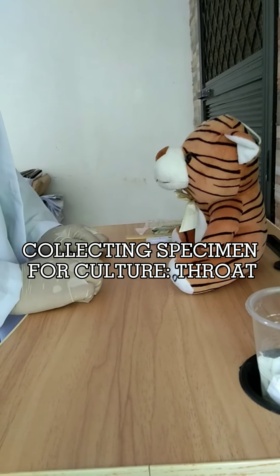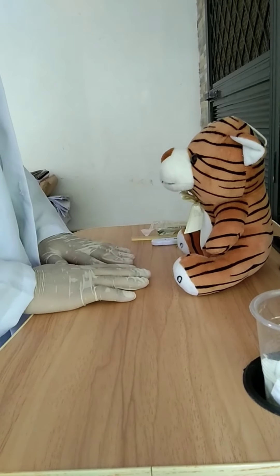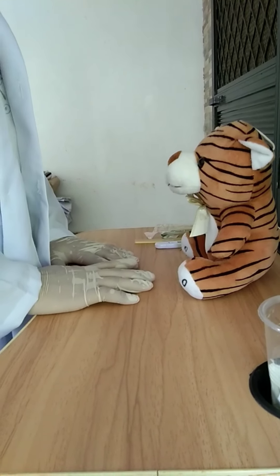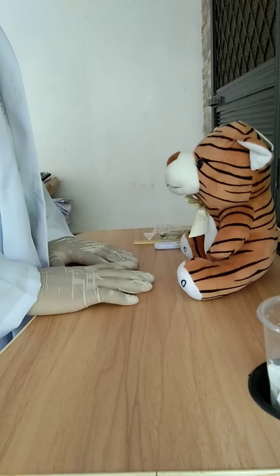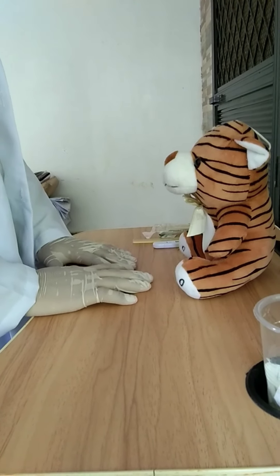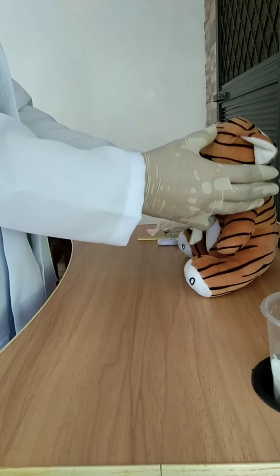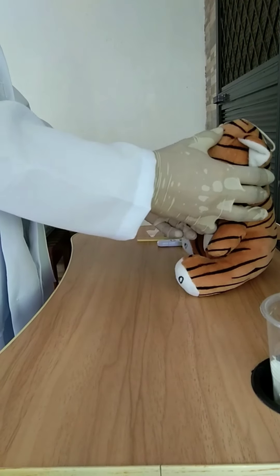Collecting a specimen for throat culture. First, explain to the client that the throat swab may cause a tickling sensation or make him or her gag. Reassure him or her that the procedure will be brief. Ask the client to tilt his or her head back, open his or her mouth, extend the tongue and say 'Ah.'